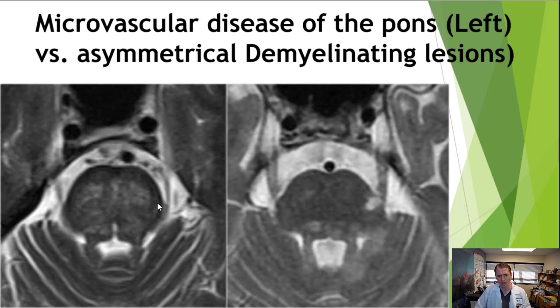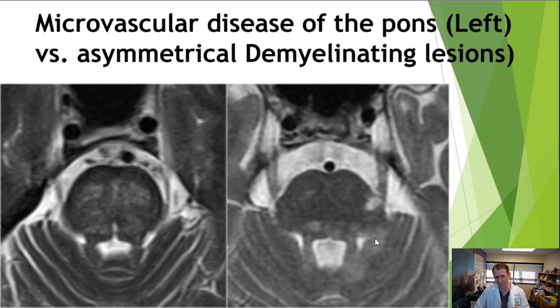These are two different images. On the left side, we see patchy symmetrical lesions very typical of vascular disease, something we might see in someone with chronic hypertension. On the right side, we see demyelinating lesions, which tend to be more asymmetrical and well-demarcated. You can see a lesion on the left pons and some changes in the left medial cerebellum. So symmetrical and patchy is more typical of vascular disease, while more distinctive and asymmetrical is more typical of demyelinating disease of the brainstem.